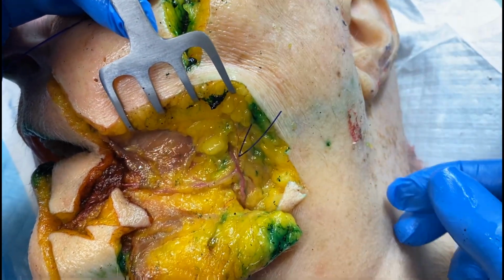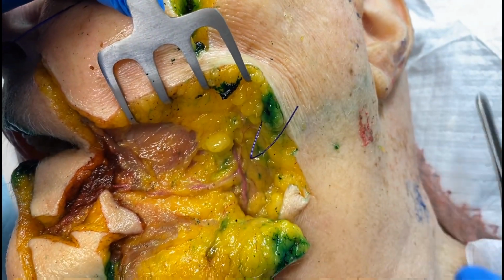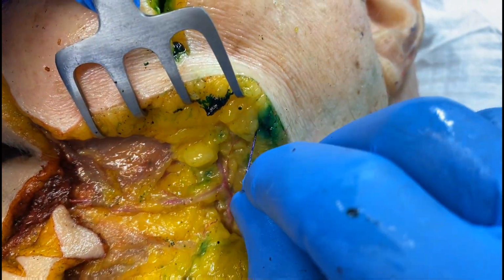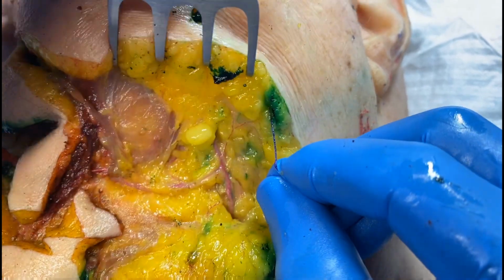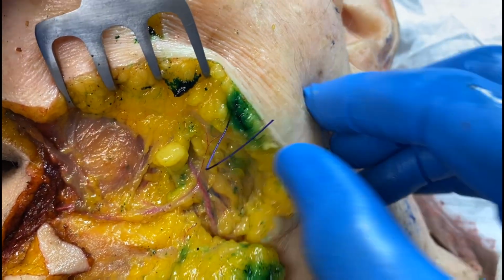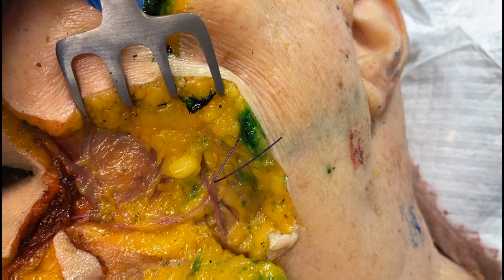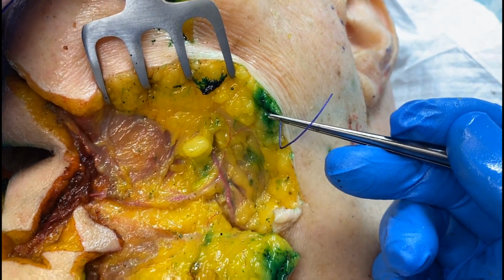Right, and you can see it. And it's something that we refer to a lot as the subdermal plane and the SMAS. And this is exactly the area that we're looking at in terms of that SMAS. And you can literally see the outline. Just hold that back a little bit. You see where that thread is right there. It's literally in that defining area, in that subdermal plane and right at the SMAS, right above the thread.